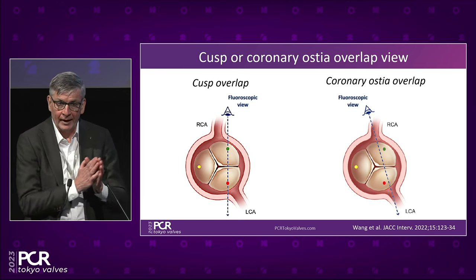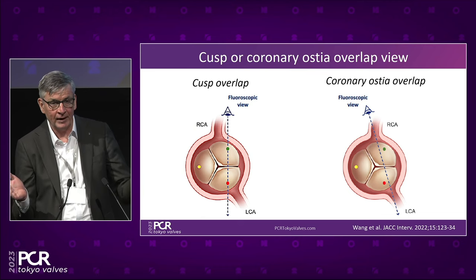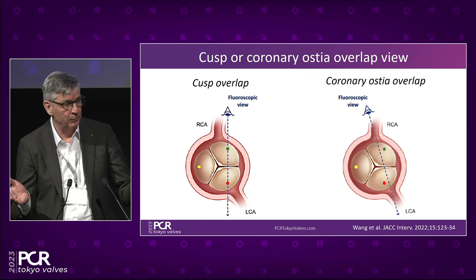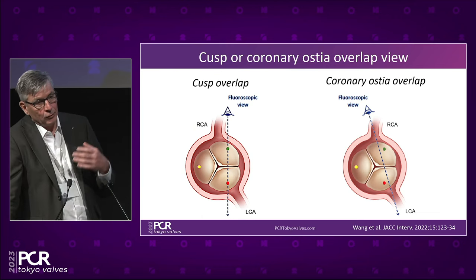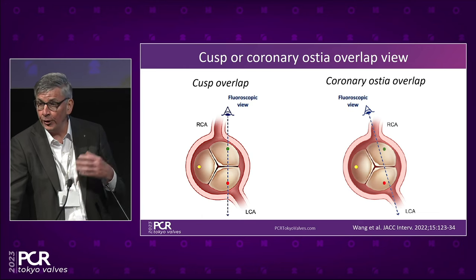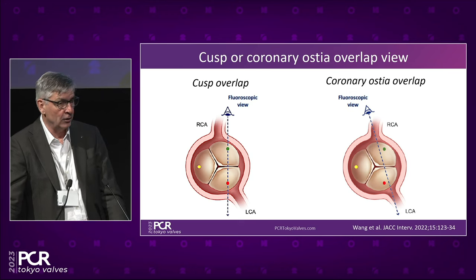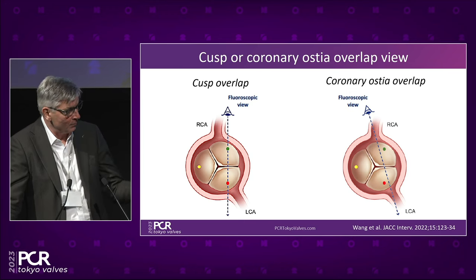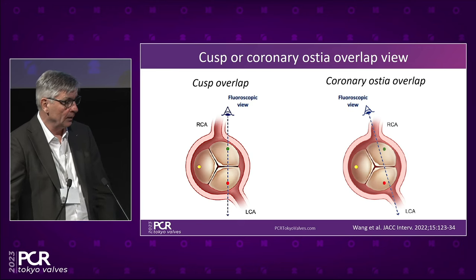Of course, what you gain on the right coronary artery, you're going to lose on the left. But I think it's better to have mild commissural misalignment for both than a very severe one for one of them. You can, of course, make a decision based on each patient. If the patient has a non-dominant right, you should maybe just forget about it and focus on the left main. So it's just to say that it's a little bit more complex than we think, because the coronary arteries are not always taking off where we expect them to, particularly in patients with bicuspid aortic valve.